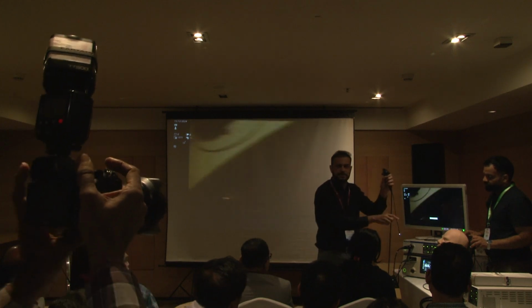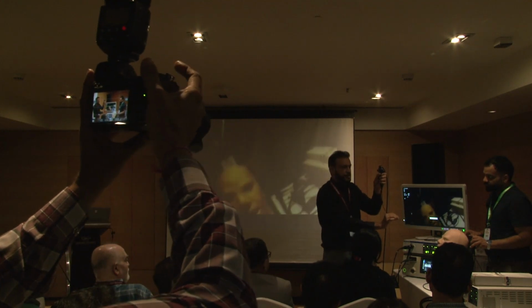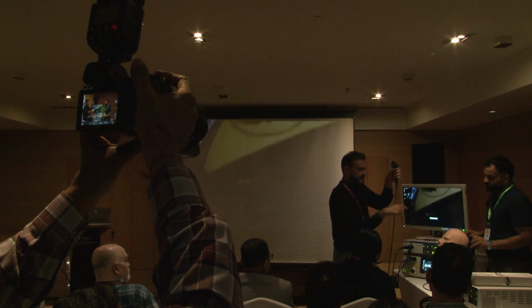Don't switch off the light. Keep the light on. I'm just saying how to hold it, because sometimes this is the problem. What happens is there are two angles which are formed. One is this angle when I'm holding it here, this curvature, which all of you try to understand.